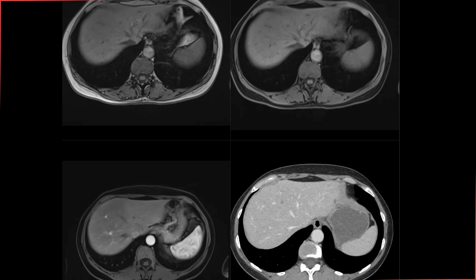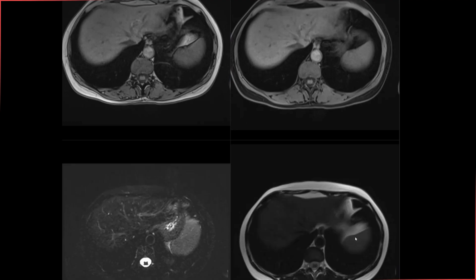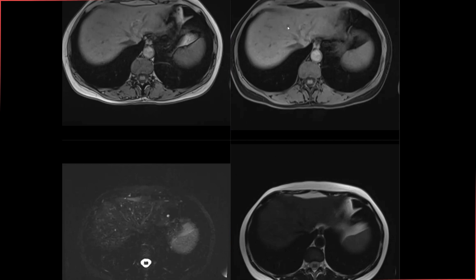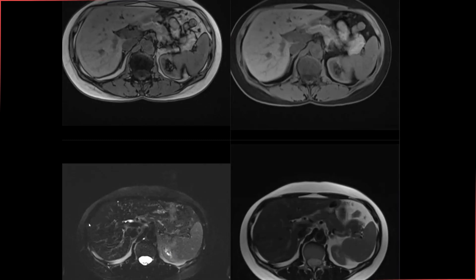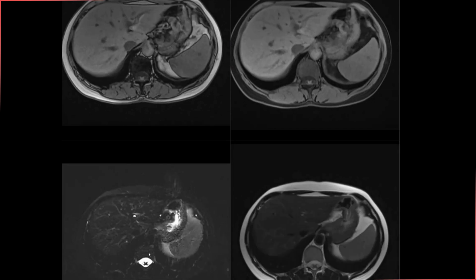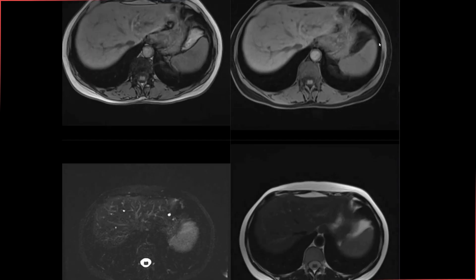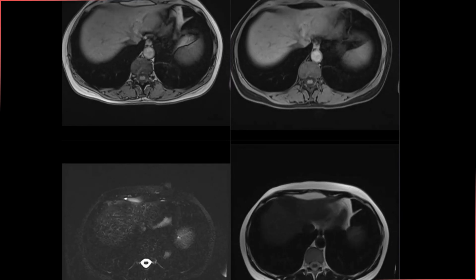Correlating with T2-weighted imaging at almost the same level, we can't see this lesion on T2 at all, which means it does not have bright signal. That is an indication that this lesion is probably different from the rest of the small focal hepatic lesions, which are most likely cysts. Now let's look at the post-contrast imaging.